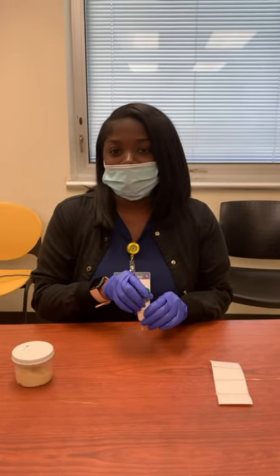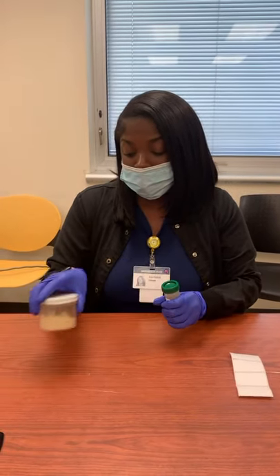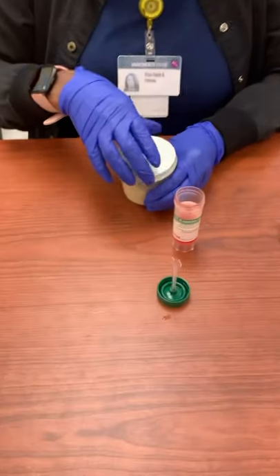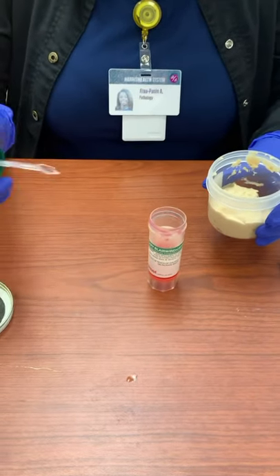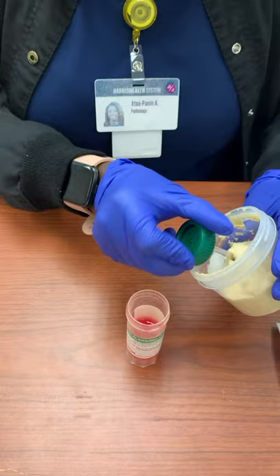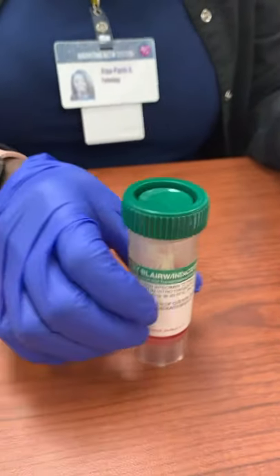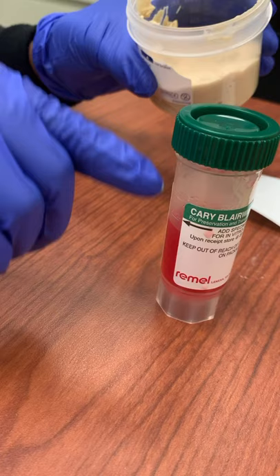We're going to start by transferring the stool inside of the Carey Blair medium. Go ahead and leave this uncapped, and make sure that the stool is soft and not too formed. Take a scoop and place it inside. We want to try to get it filled up to the line — make sure it's not too below the line and not too over the line.